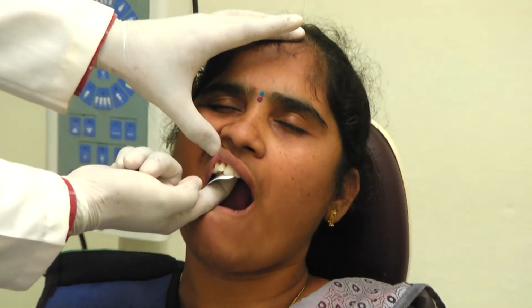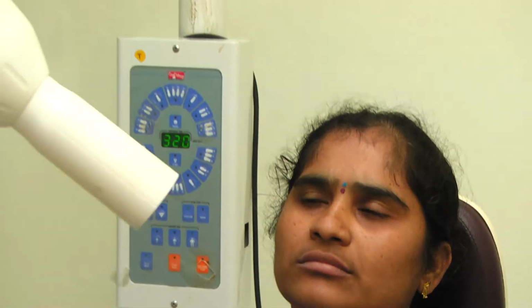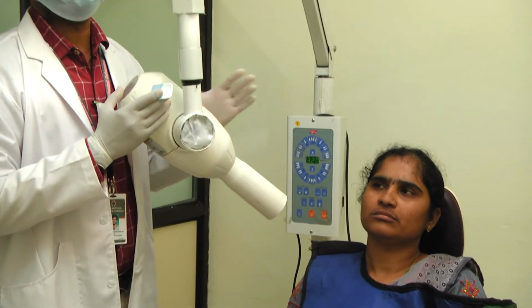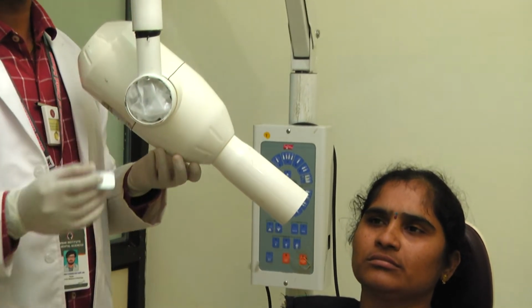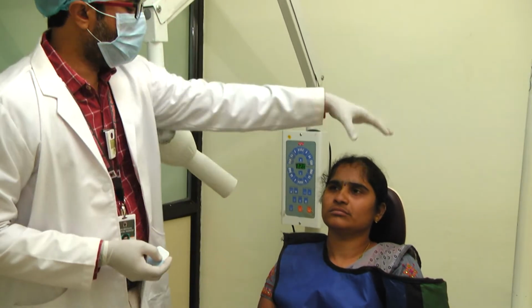This is how the placement of the film should be. Once it is done, holding the film with the patient's index finger or thumb, then adjust the cone and vertical angulation. For maxillary canine it is positive 45 degrees. So adjust the vertical angulation.